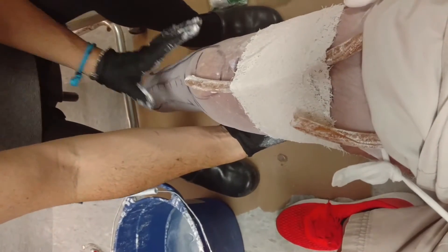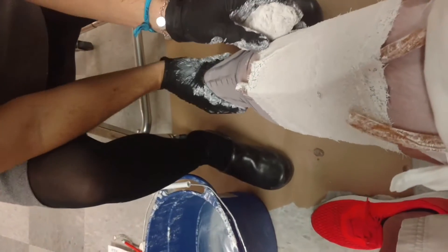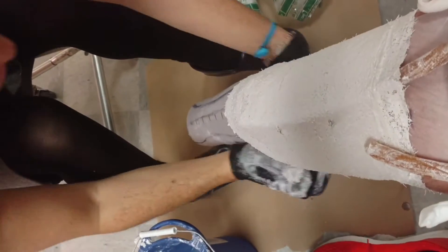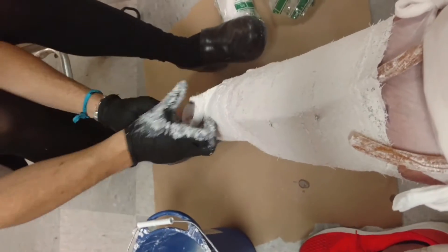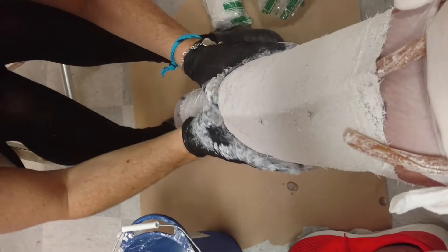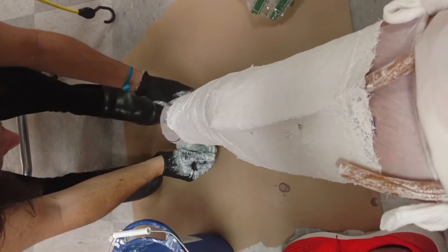To make my second leg. Does it need to be bent or straight? Bent like that. Because that's how much flexion we kind of want in the liner, at least. And they say that your second leg fits much better, because you're more the shape you're going to be. You'll notice the difference between this and when Mark casted you for your first socket — we don't deform it. We just lay it up there. We don't push on it.